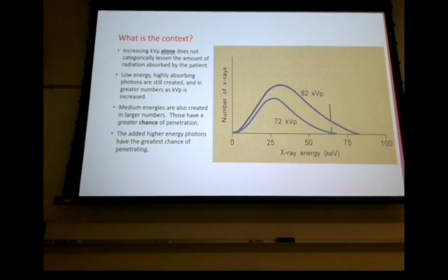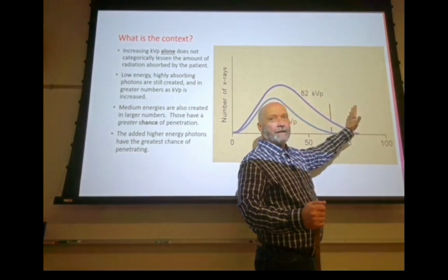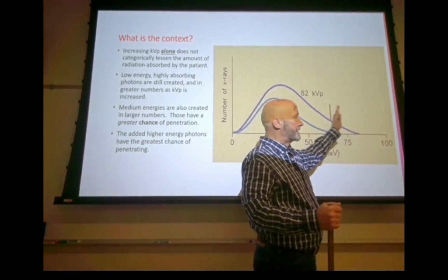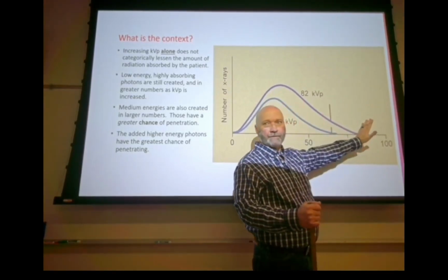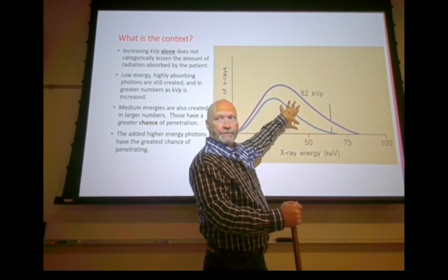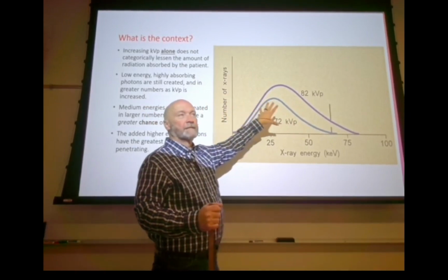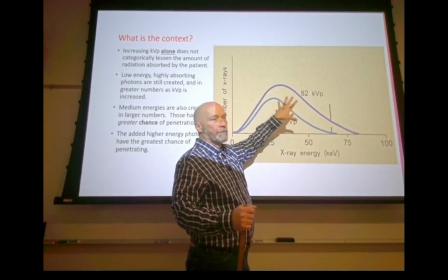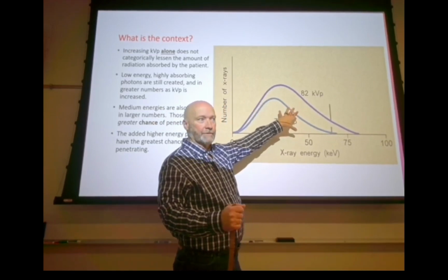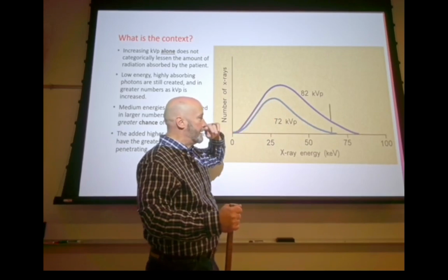So back to it, in this very simplistic scenario, we've got penetration, scatter and penetration, and full absorption. We've got scatter with absorption, scatter with penetration, and a lot is tied up in this middle section. Straight absorption.